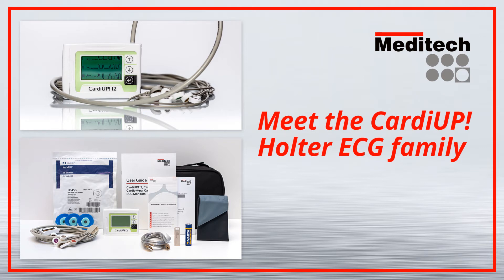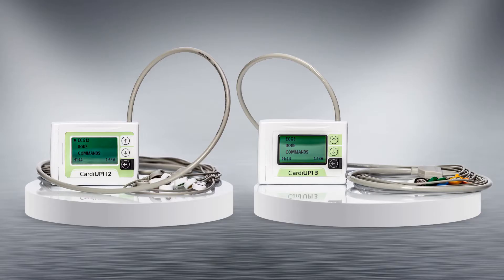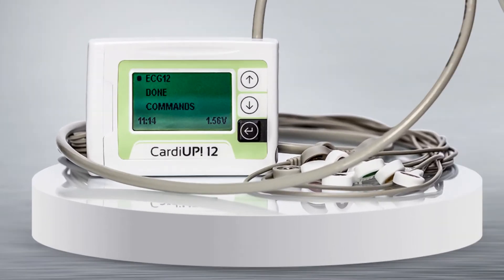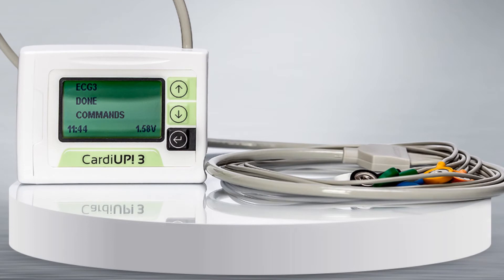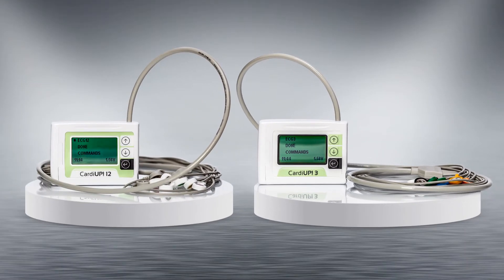Welcome to the introduction of Meditech's next generation of Holter ECG devices – CARDIAP12 and CARDIAP3. The CARDIAP12 Holter can be used as either a real 12-lead or as a bipolar 3-channel device, while the CARDIAP3 can record only on 3 channels.